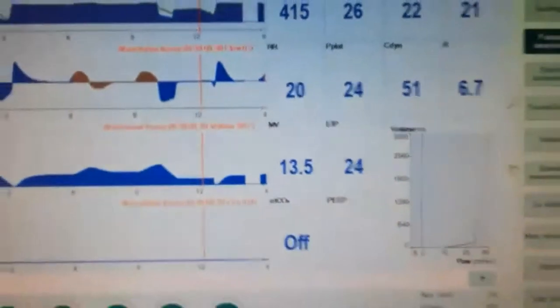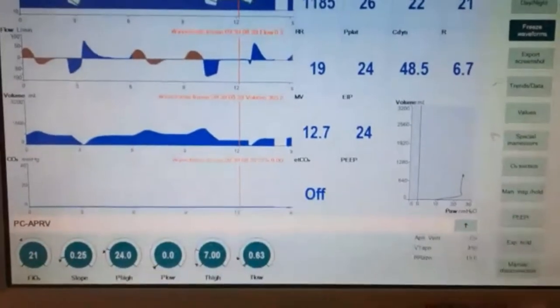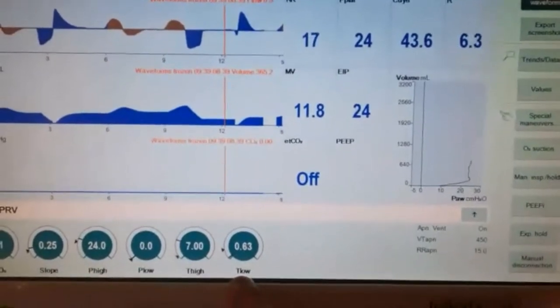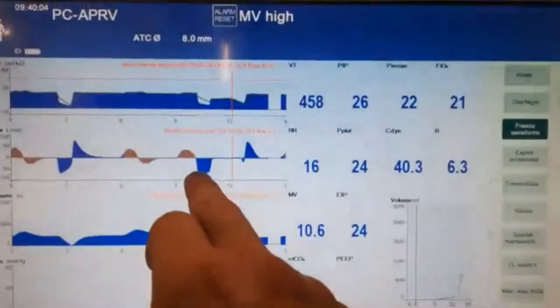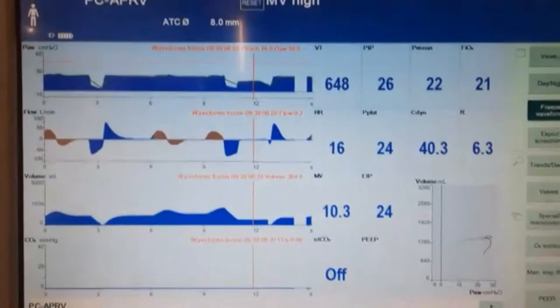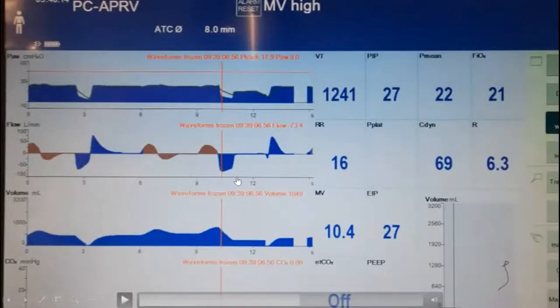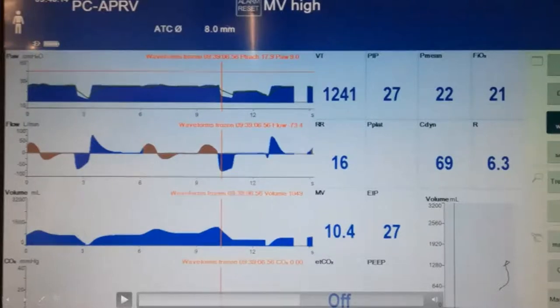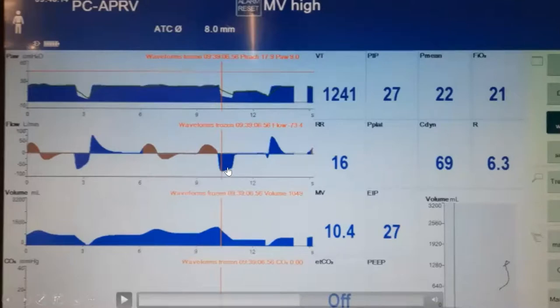We remove resistance during the release by setting P-low to zero so it's not going through a PEEP valve, getting the quickest possible release. Then we calculate T-low: the peak expiratory flow here is 73.4 L/min. Multiply 73.4 by 0.75, find the timestamp at that 75% flow value, note the timestamp at peak flow, and the difference between those two timestamps is your T-low. The key concept is peak flow and 75% — do the math, find the time difference, and set your T-low accordingly.